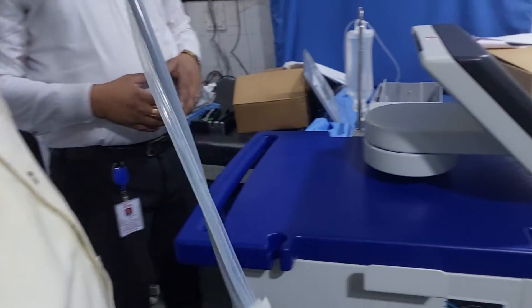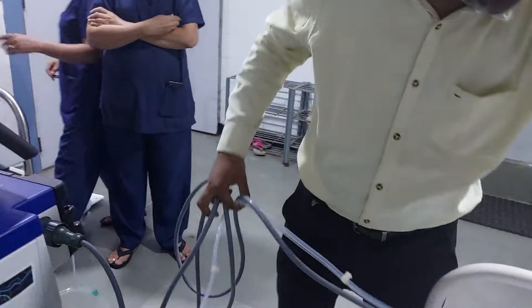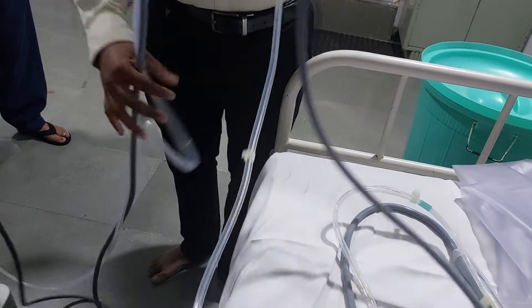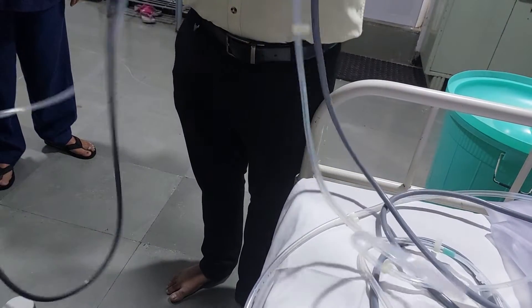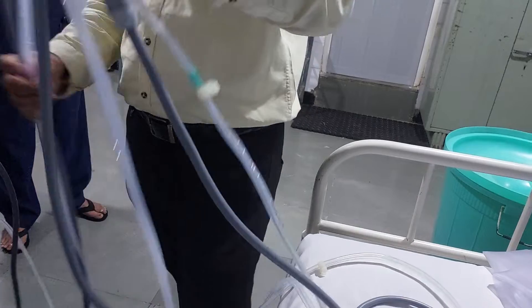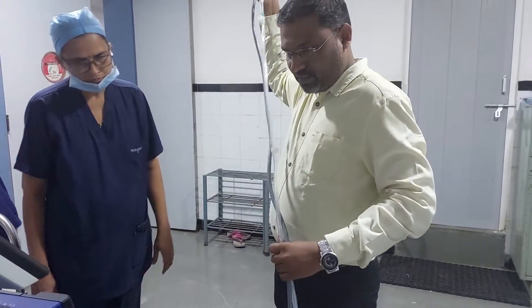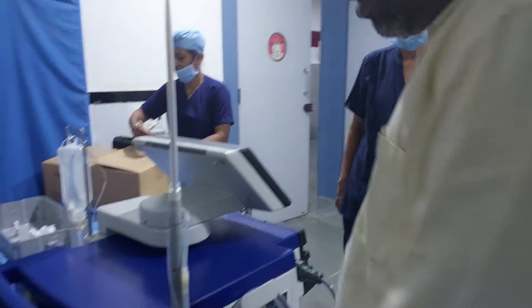This is the basic arrangement of the machine, almost done. At the time of procedure, one more thing to always remember: the length of this wire is long, so try to avoid kinking in the wire, as it can damage the wire and handpiece. Always keep it in this way to avoid twisting inside the cable. They have given a position to keep the handpiece like this.